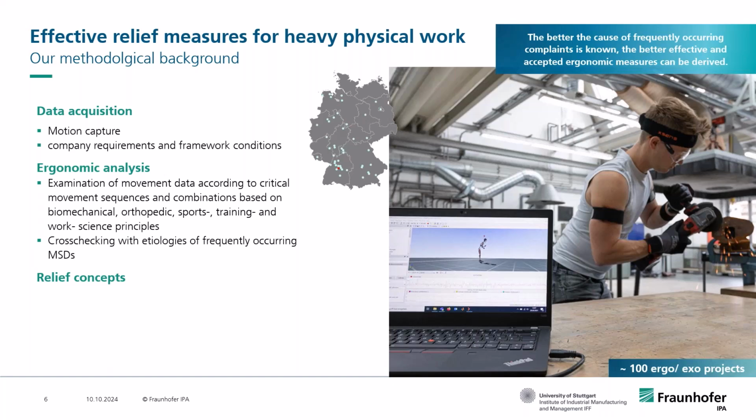And this is the difference between our method and the current pen and pencil risk analysis methods that are commonly used. Of course, you can have digital versions of them, but let's call them still pen and pencil methods. They are all based on a similar pattern of execution, mostly based on a video of a work situation.